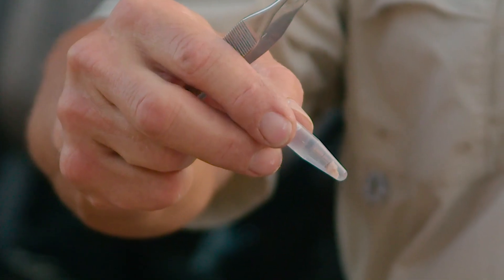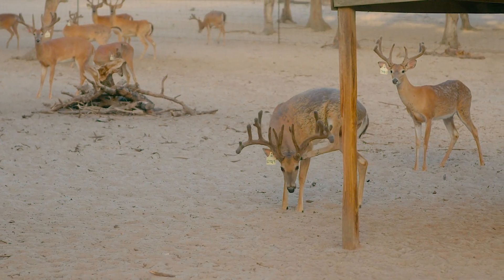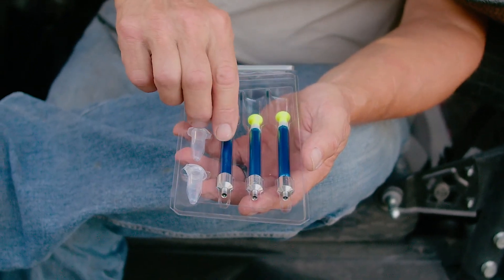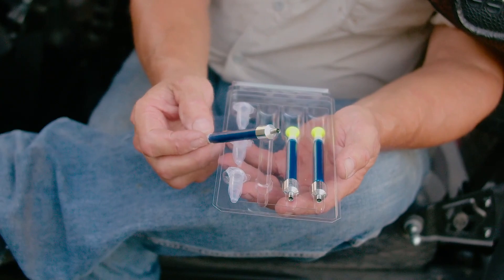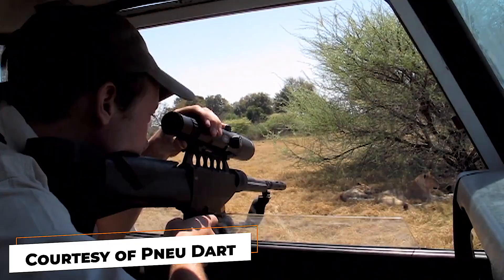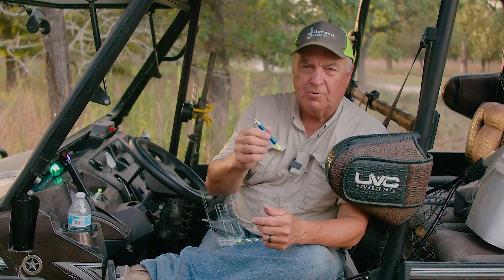We're going to do something pretty cool here. We're going to take a dart and get a sample to send in to get some DNA on a deer. These are just the coolest devices. These DNA darts are used by people all over the world — they use them in Africa on lions to extract DNA off the lions.